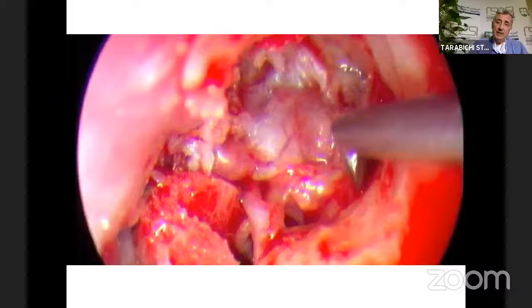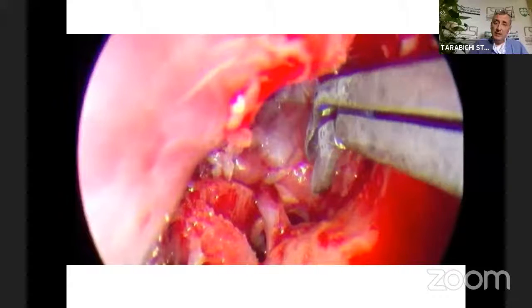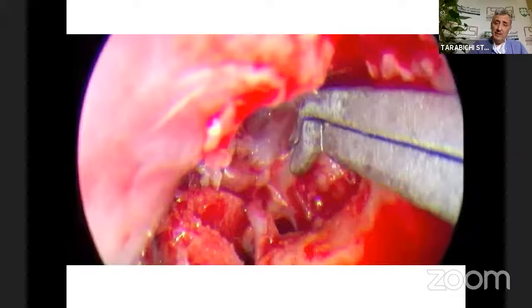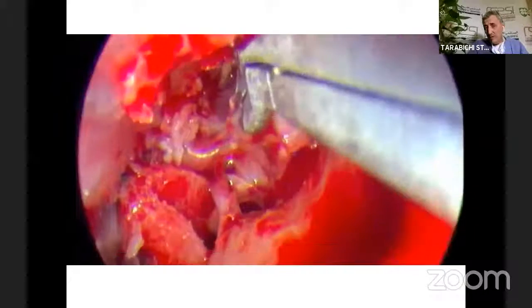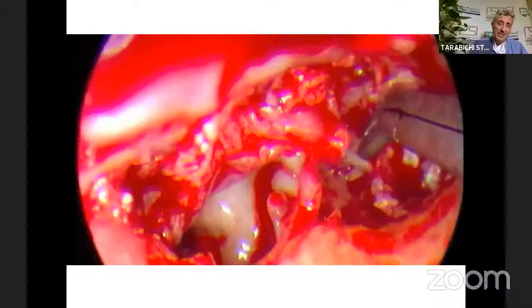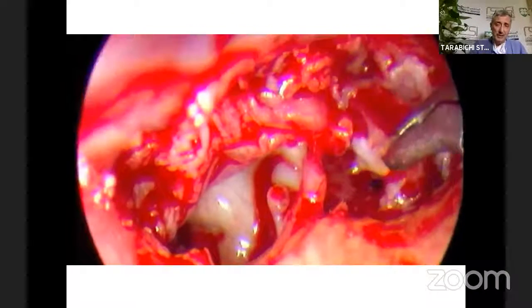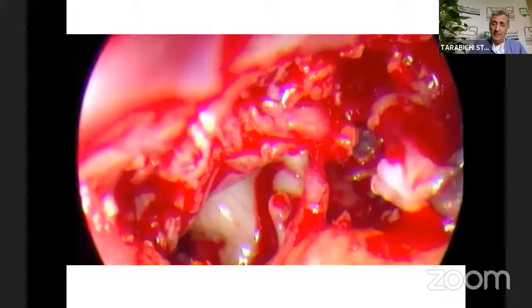And again, a lot of times I try to define the cholesteatoma away from the bone edges and really do this skin pulling technique. I find that it ends up removing a lot of cholesteatoma, even in hidden places, just by tugging at it, and really be patient. Don't tug, hold it, and just pull. Just give it time to work itself out.